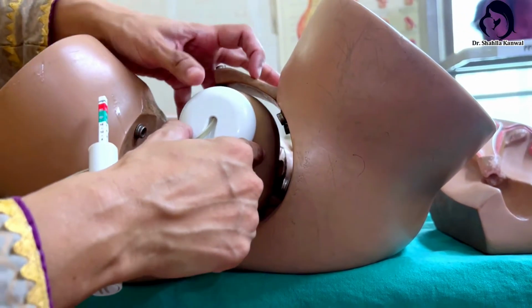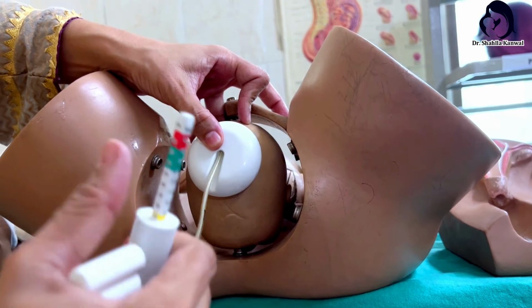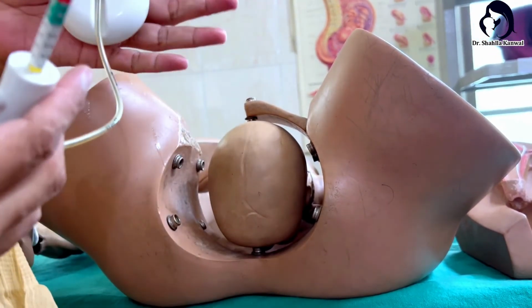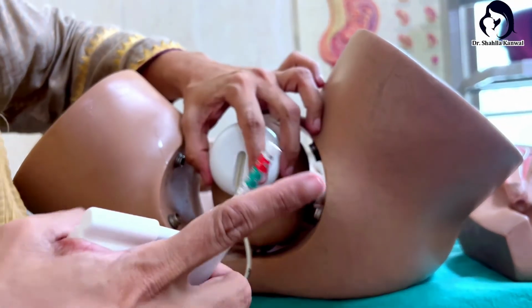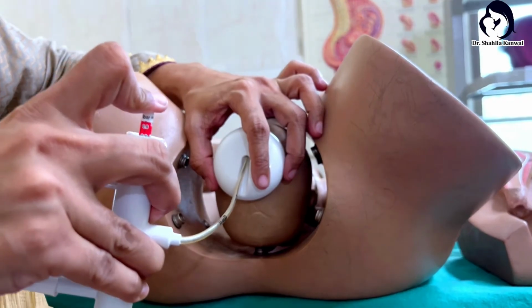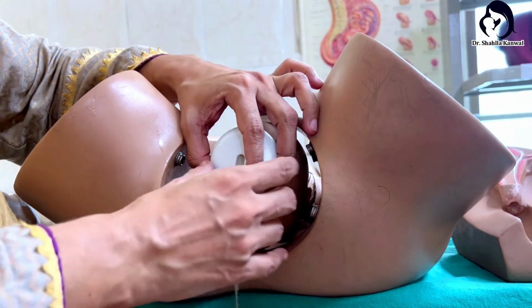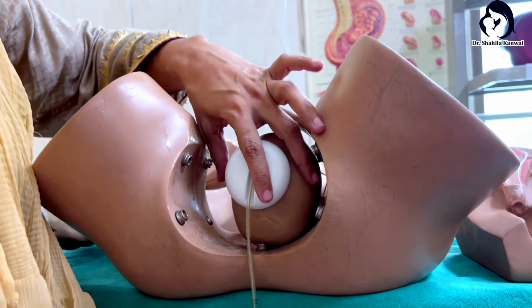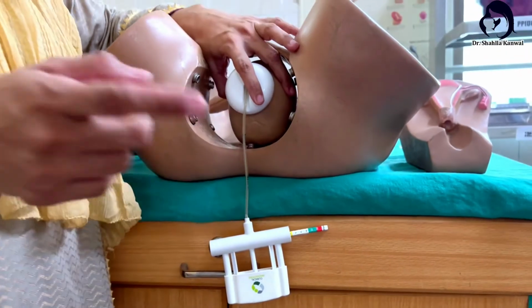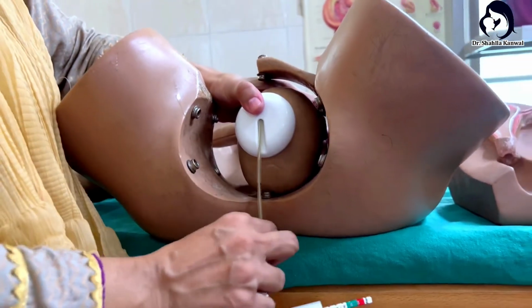After application, you have to hold it with thumb and the finger, and you have to apply the pressure, because the vacuum can't be created here. I have created the vacuum on my hand. So after application, the pressure should be applied. After the application of the pressure, you have to hang it down. First you have to apply the cup, then you have to hang it down.